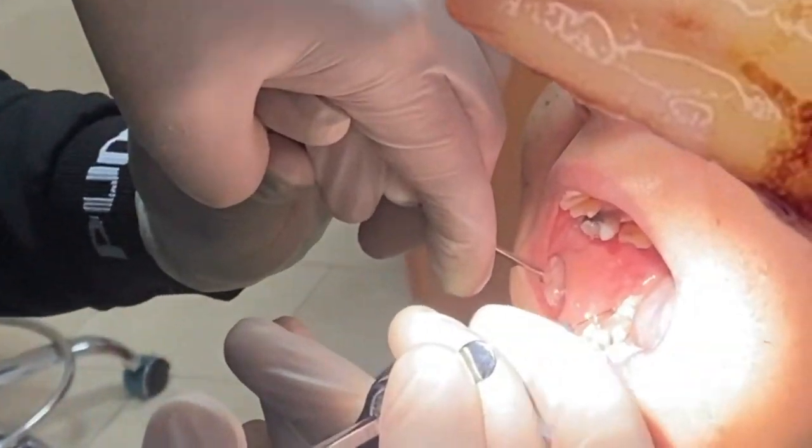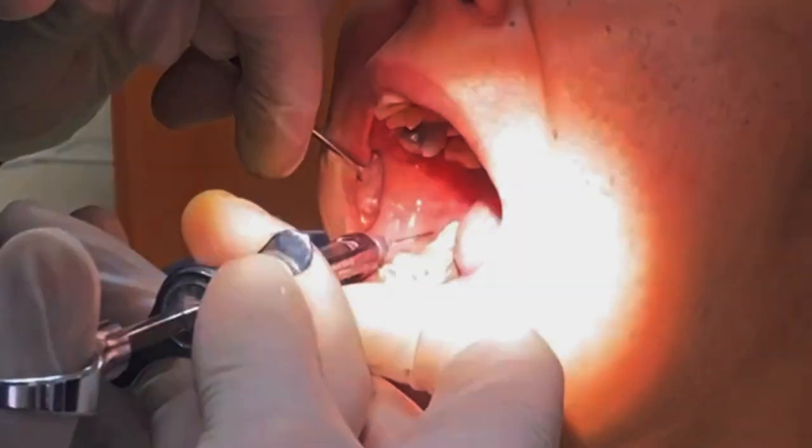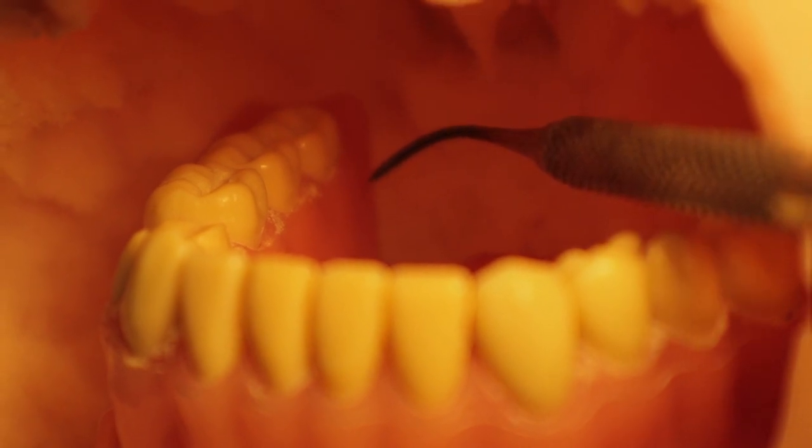For the lingual nerve, you can anesthetize it on the way out from the inferior alveolar nerve injection, by continuing to inject while removing the needle. But first I anesthetized the long buccal nerve by withdrawing the needle and injecting parallel to the occlusal plane, distal to the second molar on the cheek. Then with a new carpule, for the lingual nerve anesthesia, I injected about 1cc seven millimetres below the second molar in the gingiva from the contralateral canine. Then I waited about five minutes for the anesthesia to kick in so the patient doesn't feel anything.